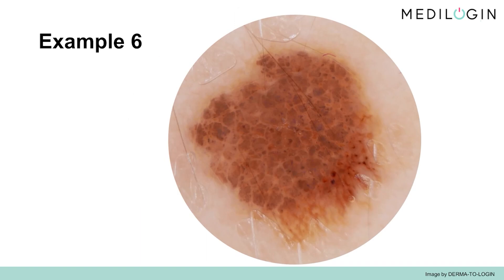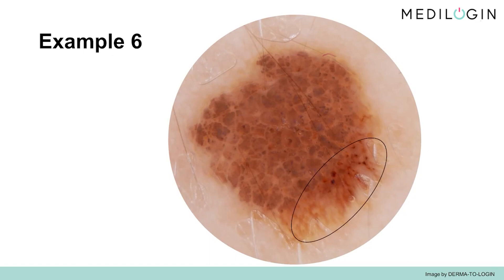Let us now move on to another example. The basic pattern of this nevus cell nevus is also characterized by clods. It is uniformly pigmented and relatively sharply bordered. One recognizes sporadic dots with dark pigmentation. However, in this border area, it is noticeable that a second pattern is added. Here you can see radial lines that have a light brown, bordeaux reddish pigmentation, and look different from the rest of the nevus.